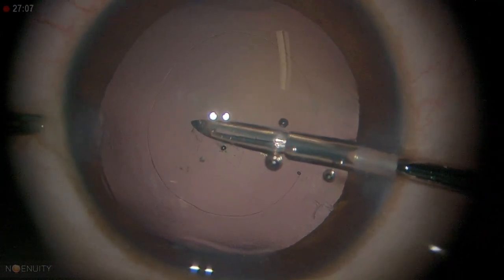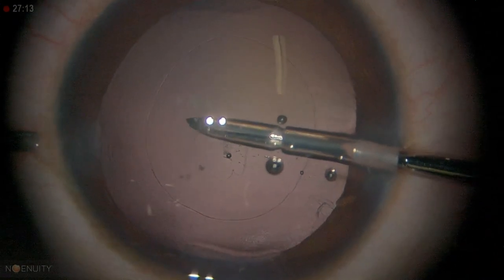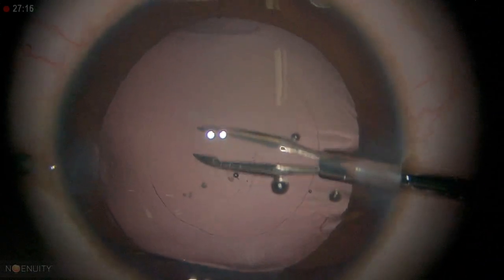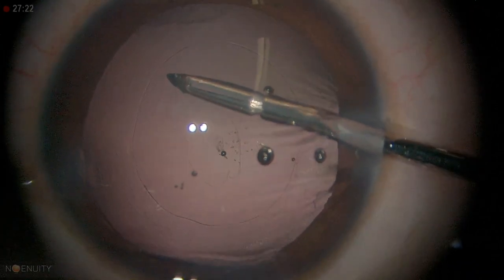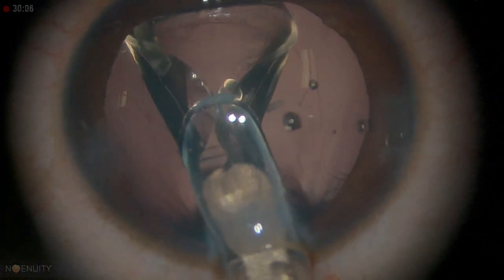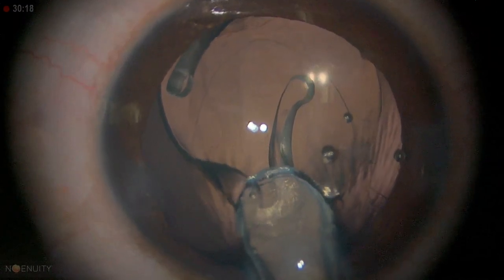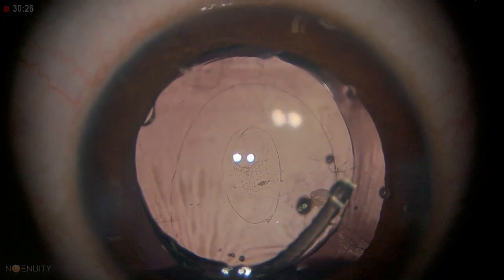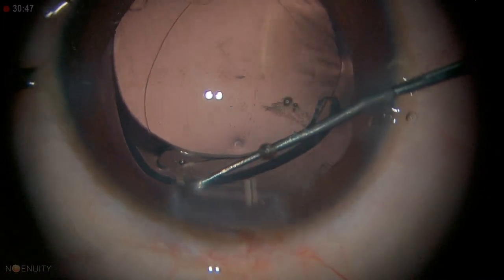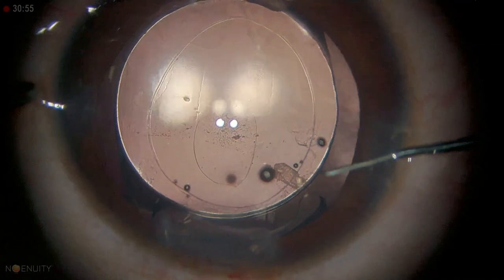We probably need to extend it with the vitrector — the capsule rhexis was not gripping it. When you do too much, the vitreous can come with it, so it's best to stop there because it can cause traction on the vitreous base. The leading haptic goes underneath the anterior capsule first; once you place the leading haptic, the trailing haptic comes into position. You don't have to do much rotation — you can just nudge it in. The lens is now in the back.